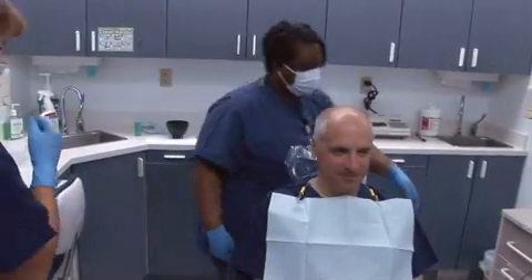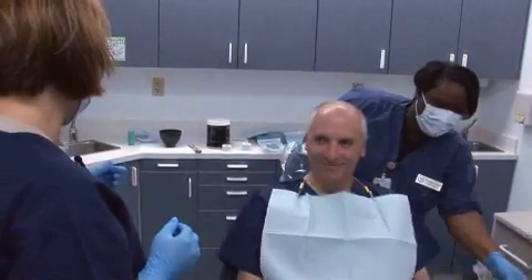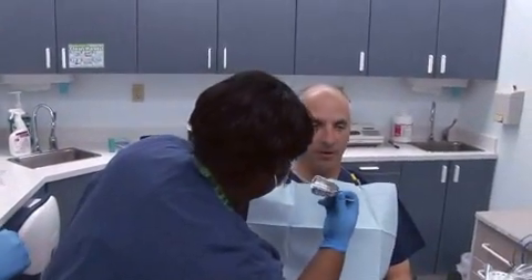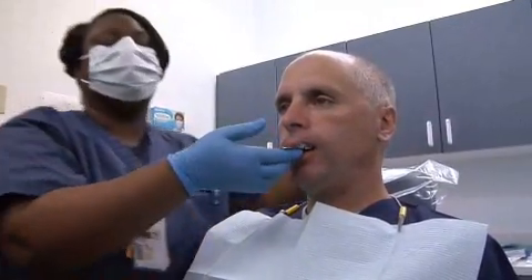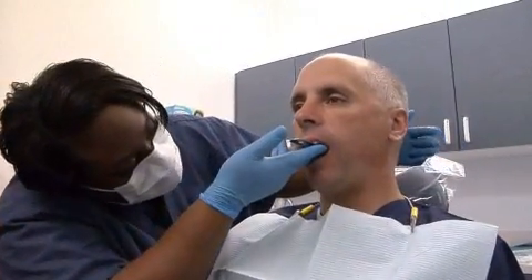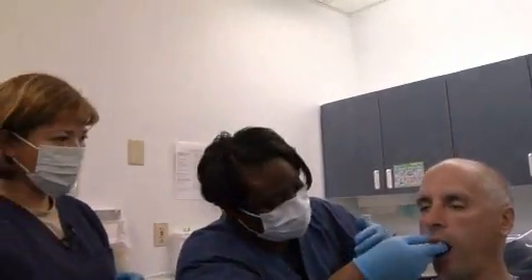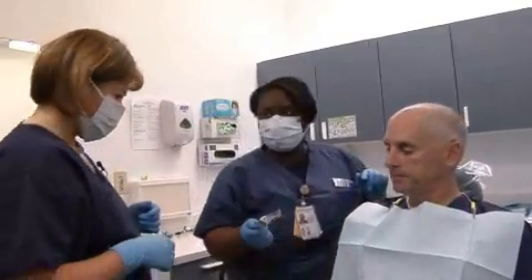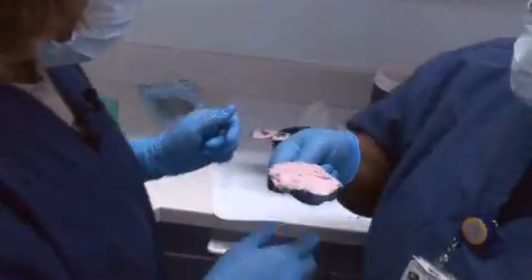Let's double check. I'm gonna raise you up some, sir. You can raise your hand if you wanna stop. Relax just a little bit. She's a pro. He is a medium. You gotta work it — don't bite all the way down, it's gonna stay open just a little bit. As I can see, it's reaching all the way to the back, so that means it's gonna give us good coverage when we take the impression. Close just a little bit, and we'll bring it out. Now we know we have our tray size.